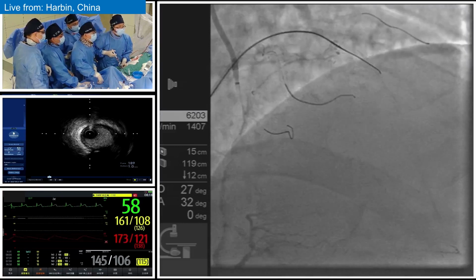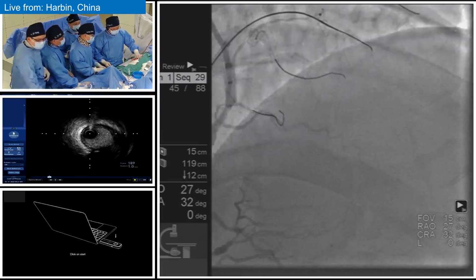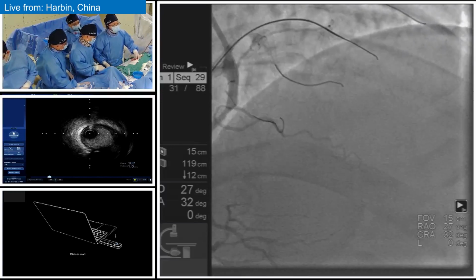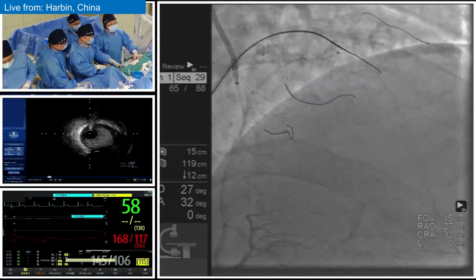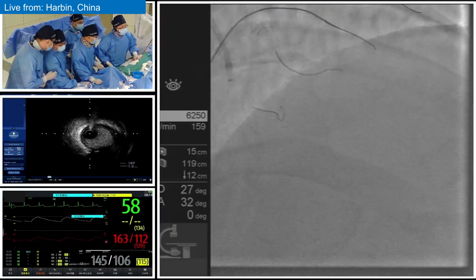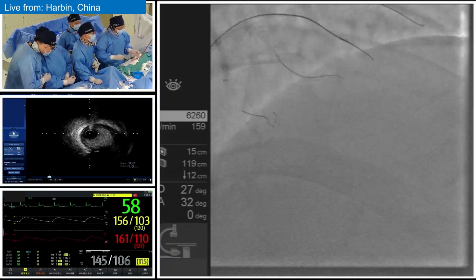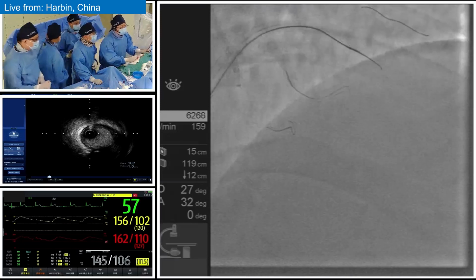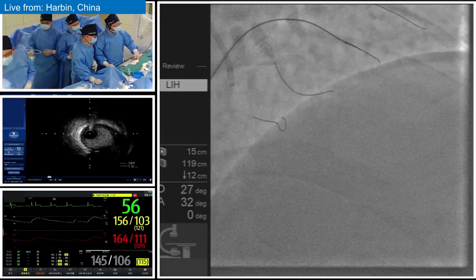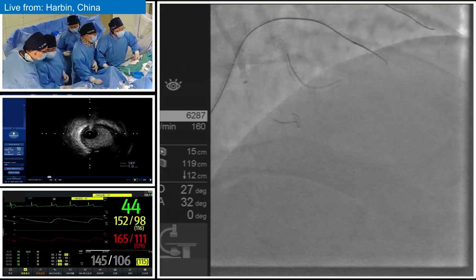Majority of the times, when the side branch diameter is less than 2 millimeters and the length is less than 60 millimeters, I think that is relatively small and doesn't cause very severe damage during the crossover and loss of the side branch. We may notice there is a second diagonal near the distal cap of the occluded segment. So as Professor introduced, we should avoid losing this relatively big second diagonal during this ADR technique.